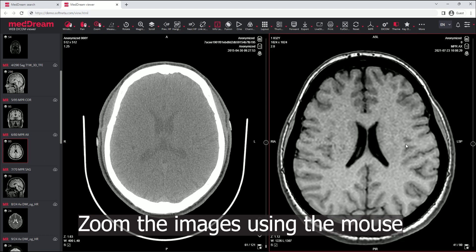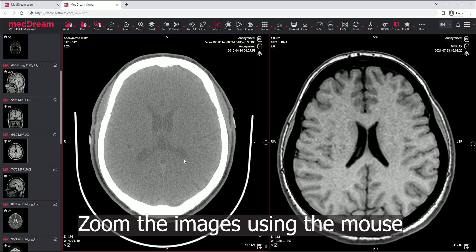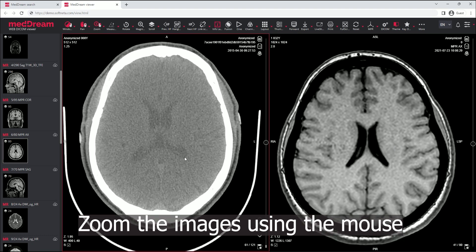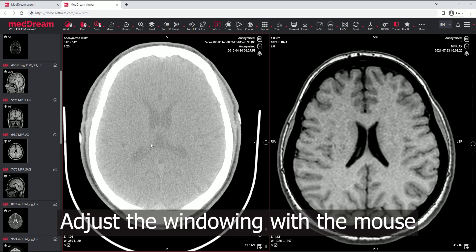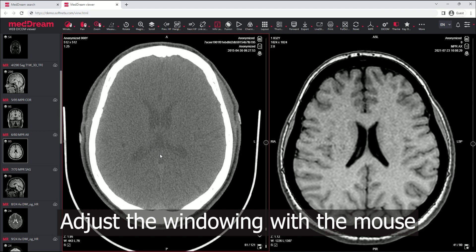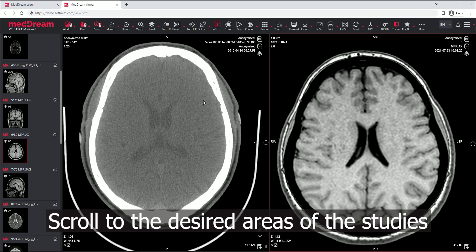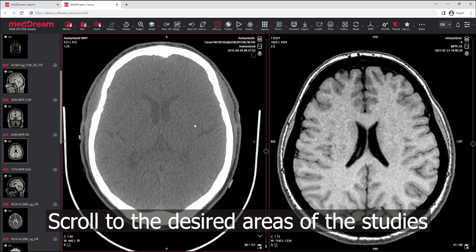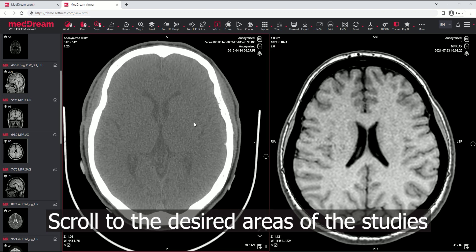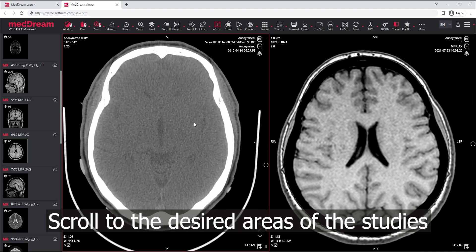Zoom the images using the mouse. Adjust the windowing with the mouse. Scroll to the desired areas of the studies.